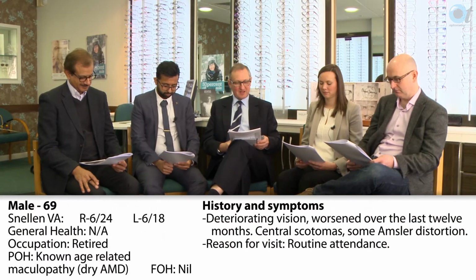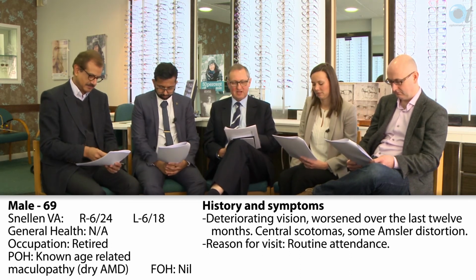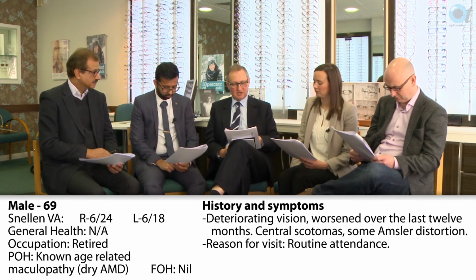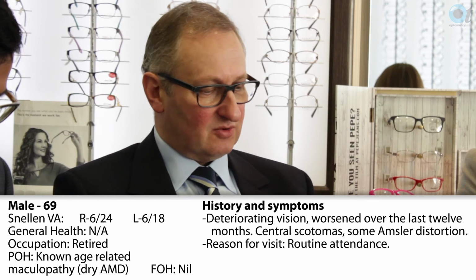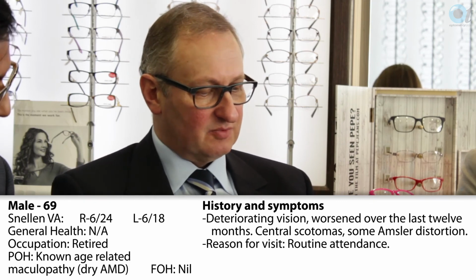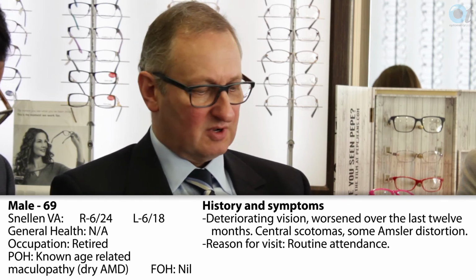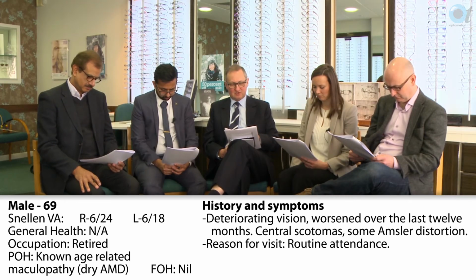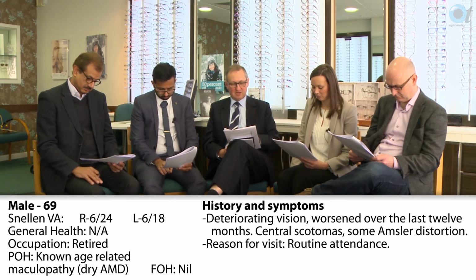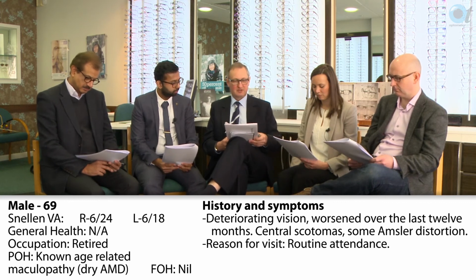This is our next patient. He's a 69-year-old man who has a history of dry age-related macular degeneration. He's retired. When we saw him, the presentation was 6/24, 6/18, and he presented with a history of deteriorating vision, particularly just worsening over the last 12 months. And there's some history of central scotomas and some distortion on Amsler. He presented just routinely for a normal refraction following a reminder letter.